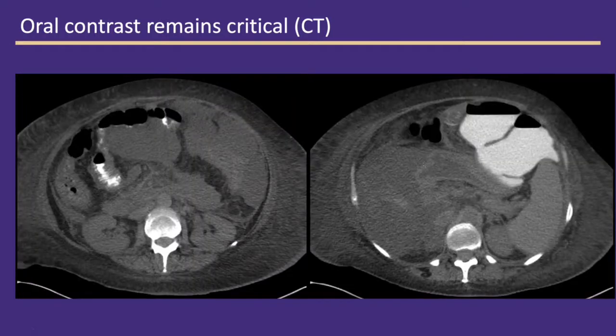Here's an early postoperative patient, image on the left, without adequate opacification of the affected segment with oral contrast material. And on the right, you see the oral contrast material with a defect in the wall and an anastomotic leak or perforation postoperatively.